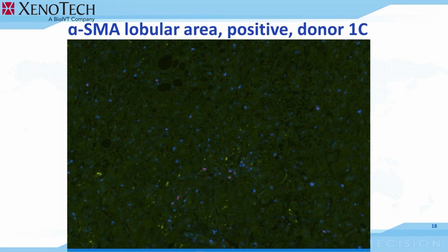So the cells with the small red dot are activated stellate cells. Hepatic stellate cells are found in the space of Disse, which is a small area between the sinusoids and hepatocytes. And the stellate cell is a major cell type involved in the liver fibrosis process, which is formation of scar tissue in response to liver damage, as we saw on an example of a cirrhotic liver slide.